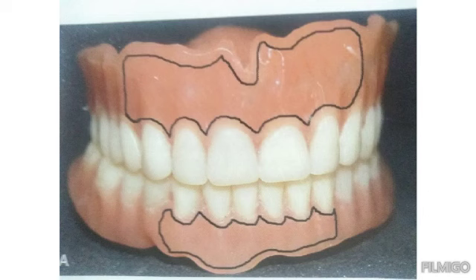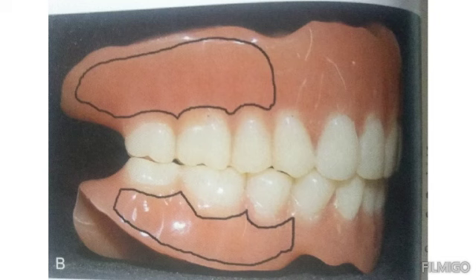This picture shows the labial flange marked with black borders. These are the labial flanges present on the maxillary and mandibular dentures, and there is a V-shaped notch. This picture shows the buccal flange of the maxillary and mandibular CD.